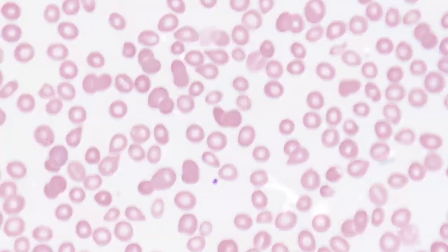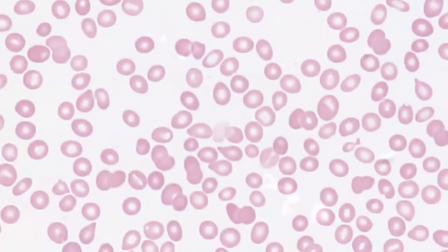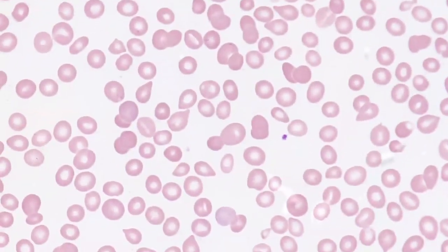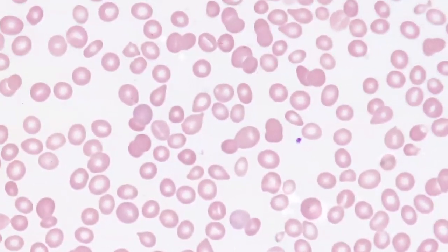Here we'll show an example of a case of myelofibrosis with increased dacryocytes, or increased teardrop-shaped red cells. So at high power, we can see that a number of these red cells show characteristic elongation of one side of the red cell with a tip at that side. And so these are appropriately named teardrop-shaped cells or dacryocytes.